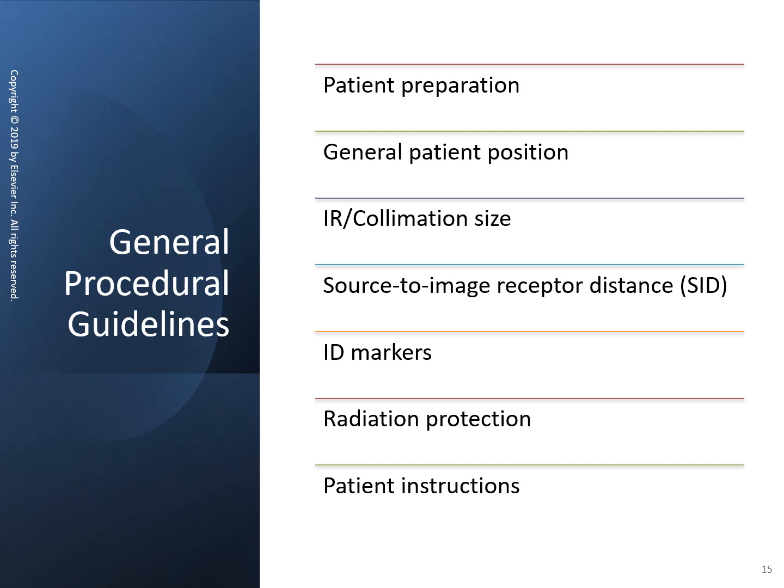For your sternum, the preferred projection, instead of an AP or PA, is a slight PA oblique, an RAO. That's going to shift the sternum over the heart muscle, give it a little bit of help with attenuation, and make it show up just a little bit better with the heart muscle in the background. You can do an LAO, but it doesn't show up as well because the sternum doesn't have a lot of calcium and a lot of bone matrix to it.